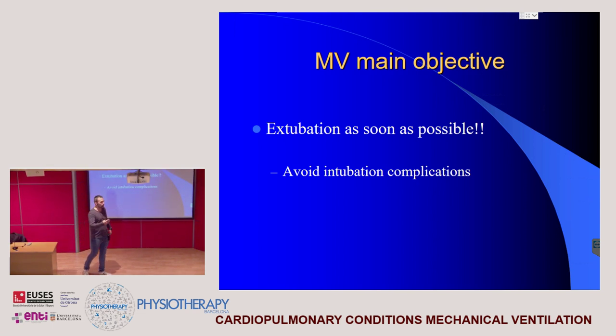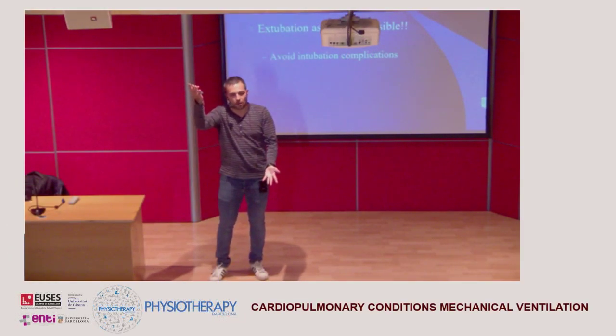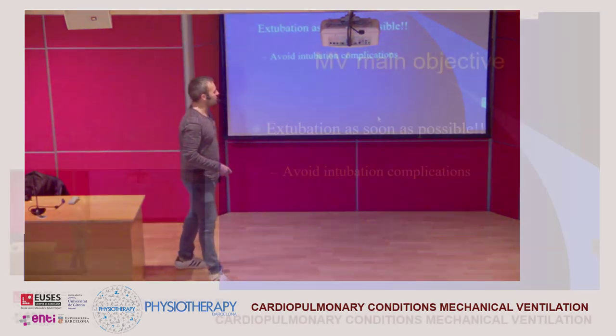This has a lot of complications and increased mortality and increased hospital admissions, and also other things that we will see right now. So from the first day the objective is to extubate as soon as possible. That balance that I have talked about, respiratory work, ventilator work and patient work, has to be reached as fast as possible. It's always like that, but it has to be the objective.